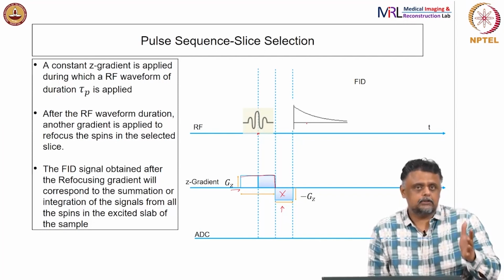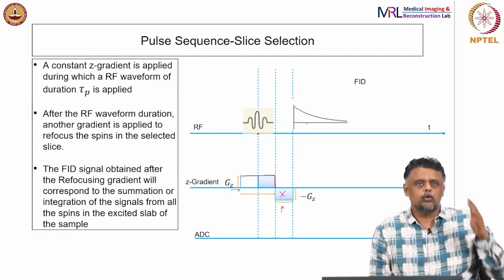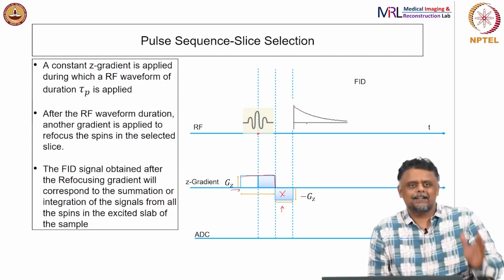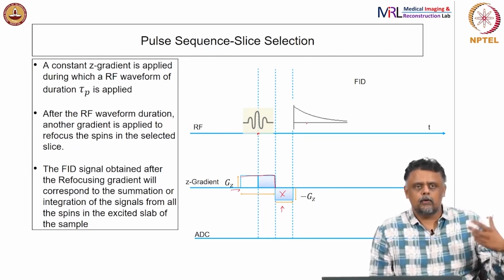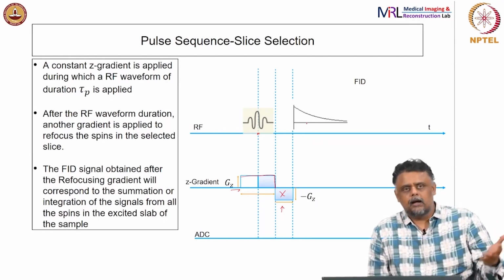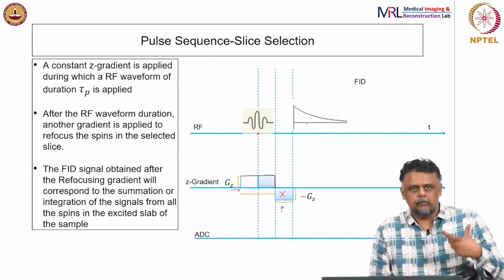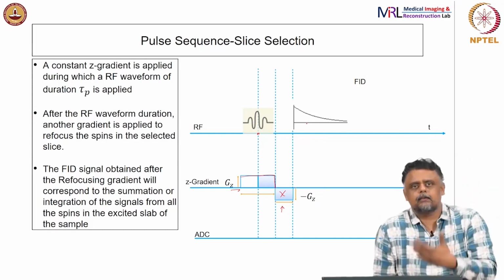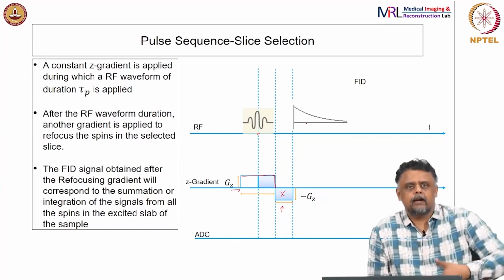But even now this is just one slice, we still cannot figure out x and y yet. We have just localized the signal to a particular z location or a range of z locations. That is why you always talk about slice width in medical imaging, in CT as well as MRI, because the image you are looking at, even though it is flat, actually comes from a slab of tissue, not an infinitely thin plane.